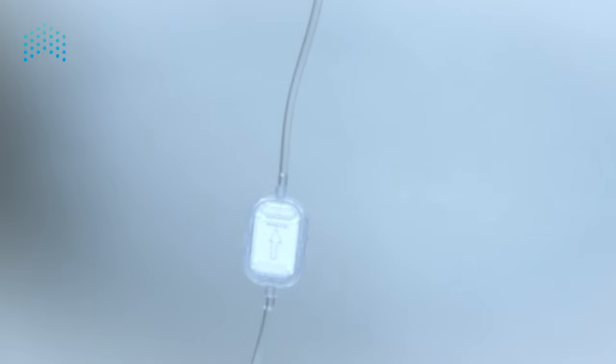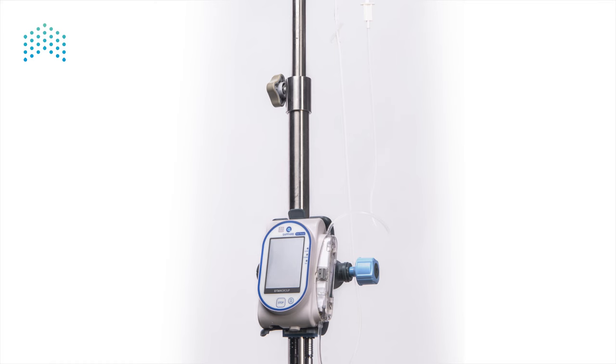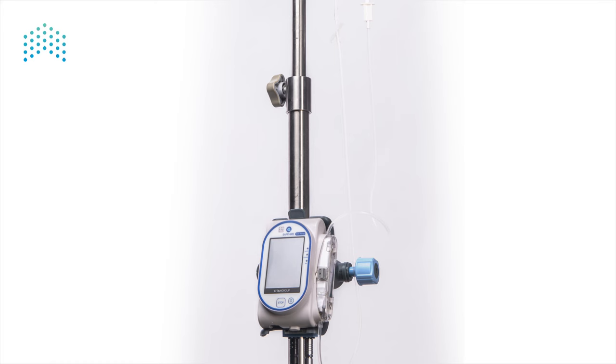If the set includes a filter, invert it during priming and position the filter lower than the end of the set to ensure proper wetting of the filter. This completes the setup — the pump is ready to be programmed, connected to a patient, and start the infusion delivery.